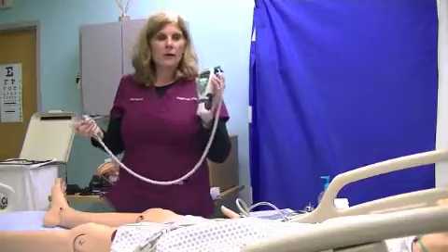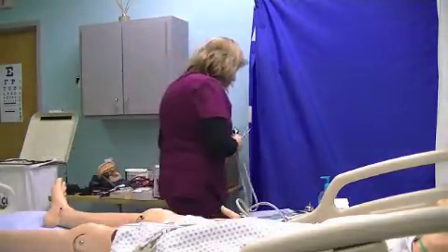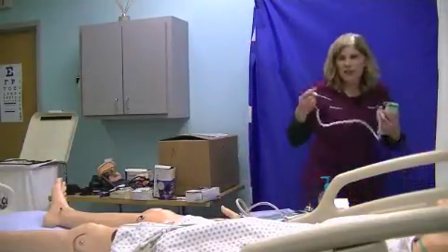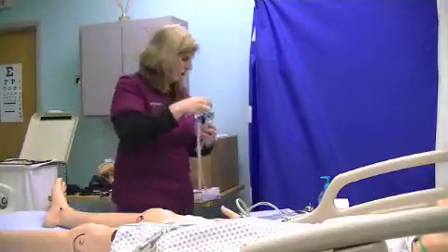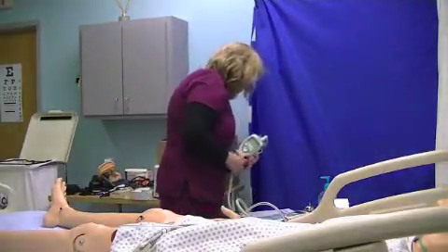And then when it's done, it will beep. 99.0 degrees. And so we're going to make sure that we put this in the trash can. You can just push the end of it and the sheath will come off into the trash can. When you're putting the sheath on, be careful, because if you push this, it can cause it to fly across the room. So we want to make sure.